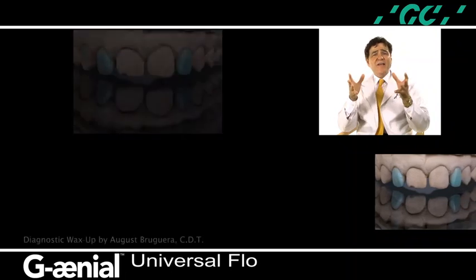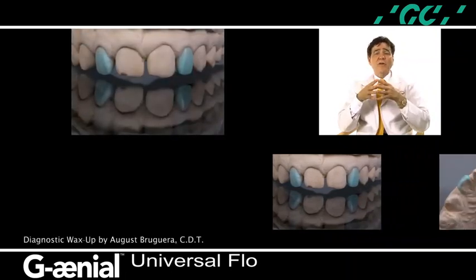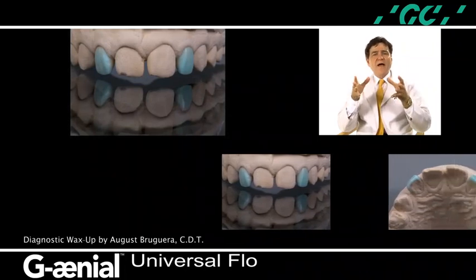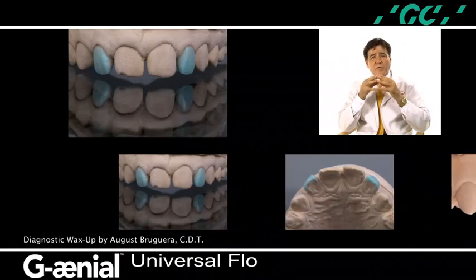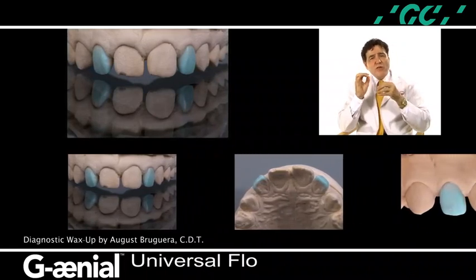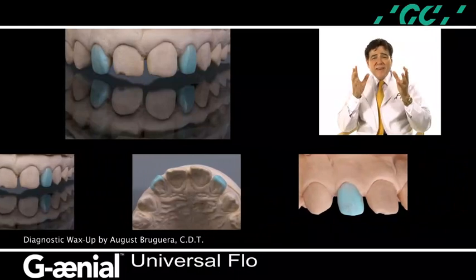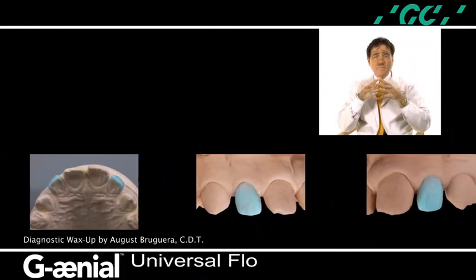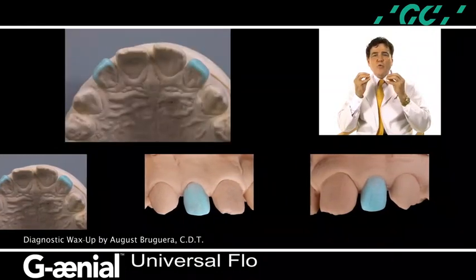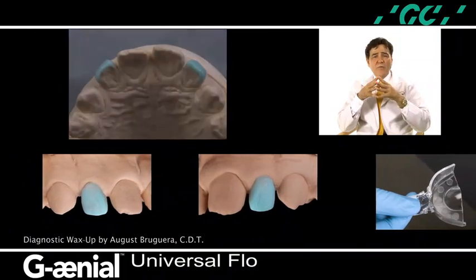After review with the patient and orthodontist, a diagnostic wax-up is designed to modify the size and shape of the maxillary laterals. This wax-up allows the team to evaluate form and function, and if this wax-up is precise, it can be translated using this indirect direct flowable composite resin technique for an immediate visualization by the patient and the restorative team. A diagnostic wax-up is created to change the size and the shape of the maxillary laterals.